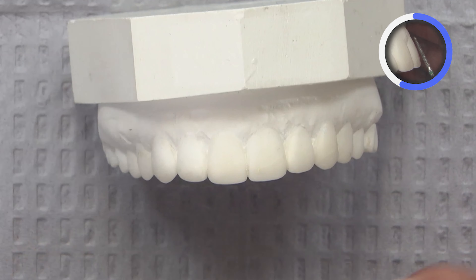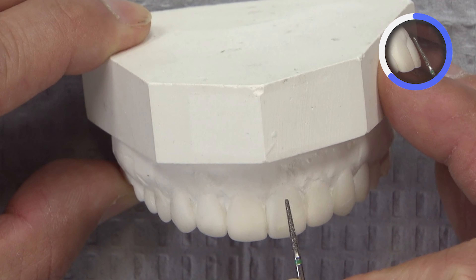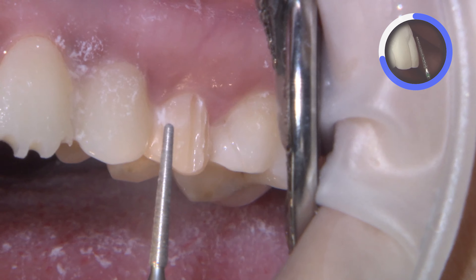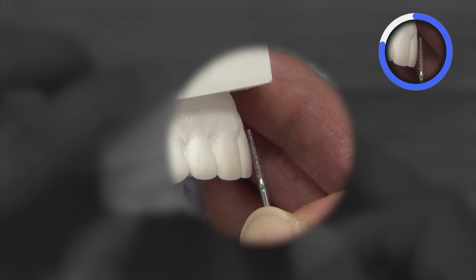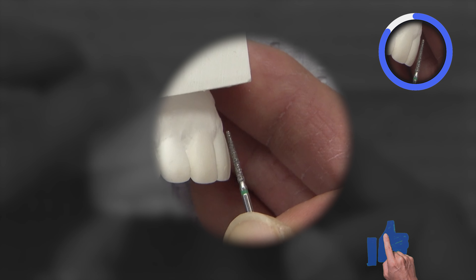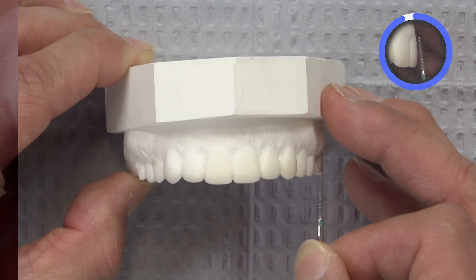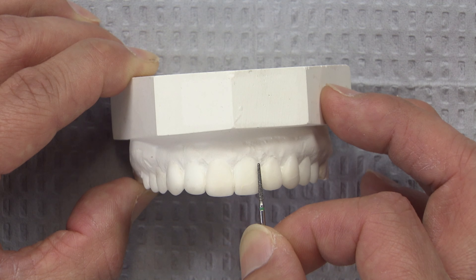The tip of this burr is approximately 0.8 millimeters in diameter. I create the depth cuts on the facial aspect first along the gingival margins, ensuring that I get down to where the tip of the burr is buried, and then transition and round this over. Since this surface is flat, I ensure the marginal depth cuts are created first, then roll over to the incisal edges on each tooth. I create three along the facial and one on each of the line angles to make sure enough reduction is created in those aspects.